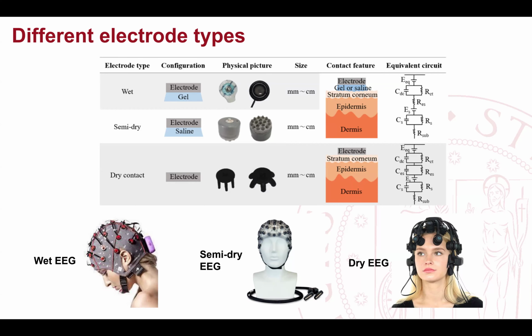But it requires shaving your hair completely, and they place a grid of very tiny channels on top of your scalp that you can remove, but the content is fully covering. Then by machine learning, signal processing, and convolutions, they really achieve very interesting results. I analyzed one of their data sets once when I was in their company for some months, and you can really distinguish the movement of the fingers with their data. This is something that is super complicated with EEG, and they managed to do something similar. It's super expensive and requires shaving, but it's still better than an intervention.